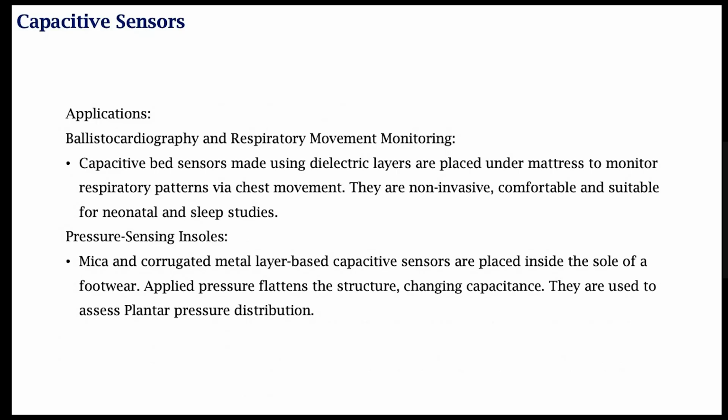Because it is MEMS based, it will be really, really small, and so this fundamental sensing principle can be used to measure pressure intravascularly.